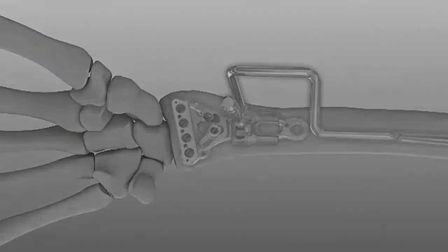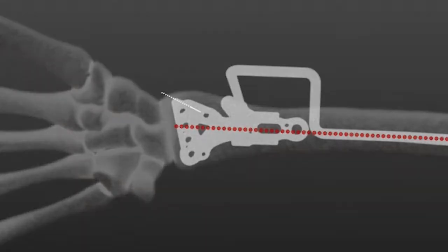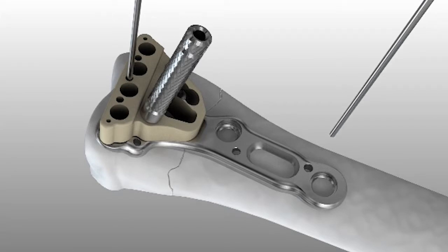Under fluoroscopy, the handle extends the length of the plate shaft's projection against the radial diaphysis in an AP view. This is used to accurately place the proximal shaft of the plate in alignment with the center axis of the radial diaphysis. The plate handle can be used in conjunction with the radiopaque styloid post and the targeting guide for precise plate placement.